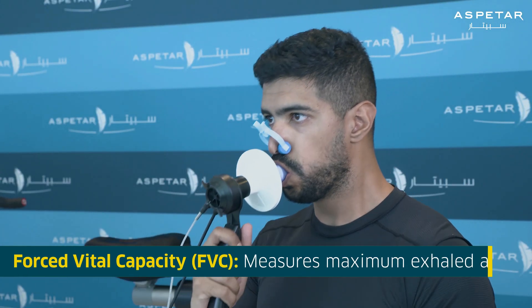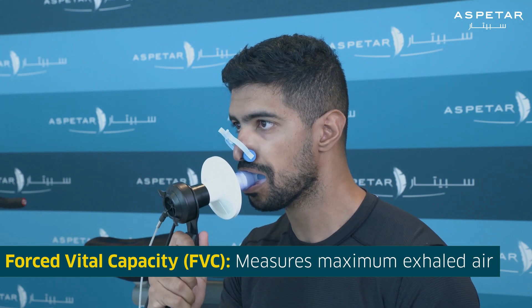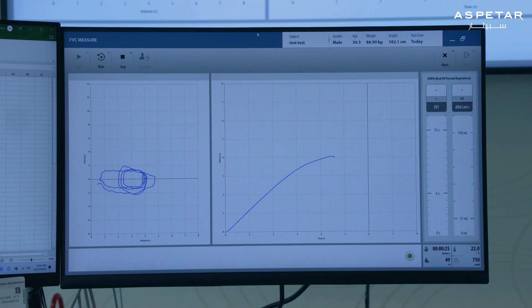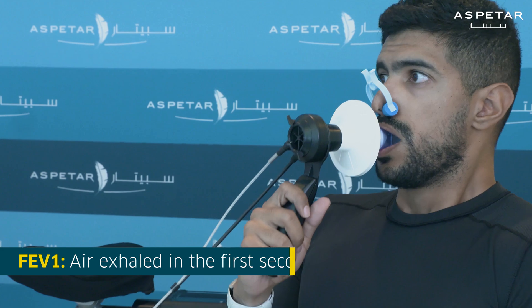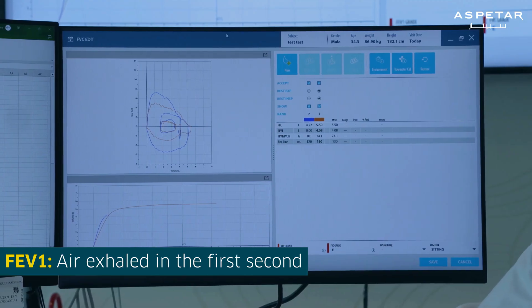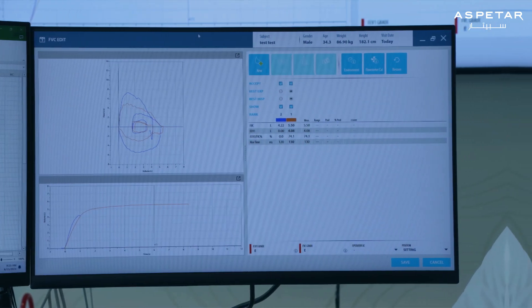There are many kinds of spirometry tests, but the most common type is the forced vital capacity. The forced vital capacity test measures the maximum amount of air you can forcibly exhale from your lungs after fully inhaling. Another important measurement is the maximum volume of air that a person can exhale in the first second, or forced expiratory volume.